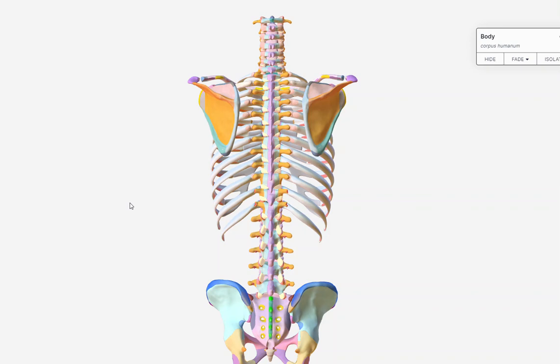That means the x-ray is going to enter the patient's back and exit their front. That is called a PA projection, posterior-anterior projection. Entering the body posteriorly, exiting the body anteriorly, PA projection. Now, if we rotate the patient into what we call an oblique, in this position, they would be called anterior obliques. We name our obliques.